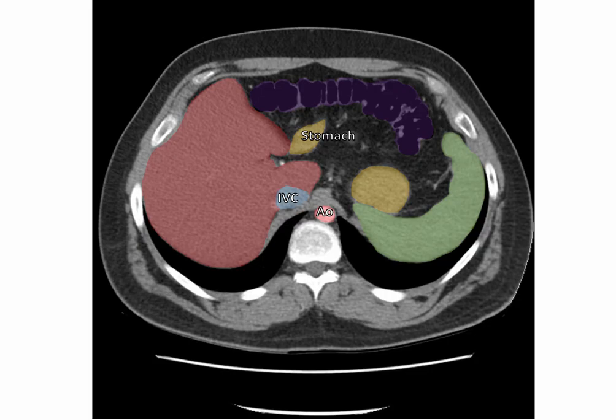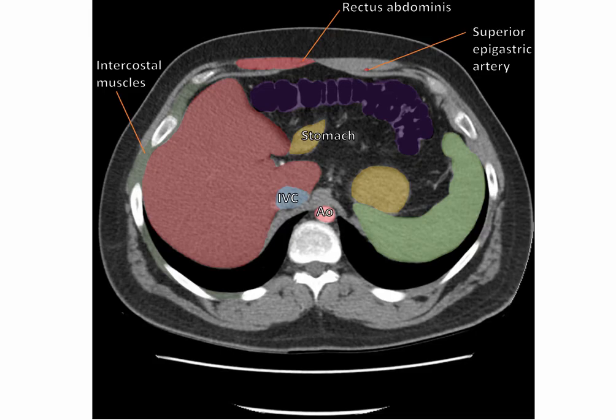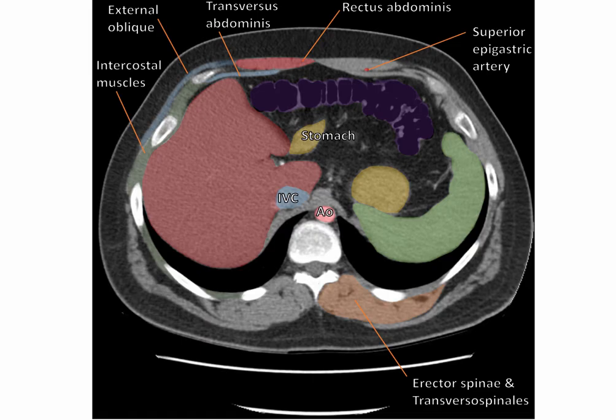We can also identify muscles in the thoracic wall. Here are the rectus abdominis muscles, with their underlying superior epigastric vessels. Here are the intercostal muscles. We can also start to see some of the superior aspects of the external oblique and the transverse abdominis muscles. Posteriorly, we can see the erector spinae and transversospinalis muscle groups. More laterally, we can also see the latissimus dorsi muscle. We can also see the spinal cord traversing the vertebral canal.